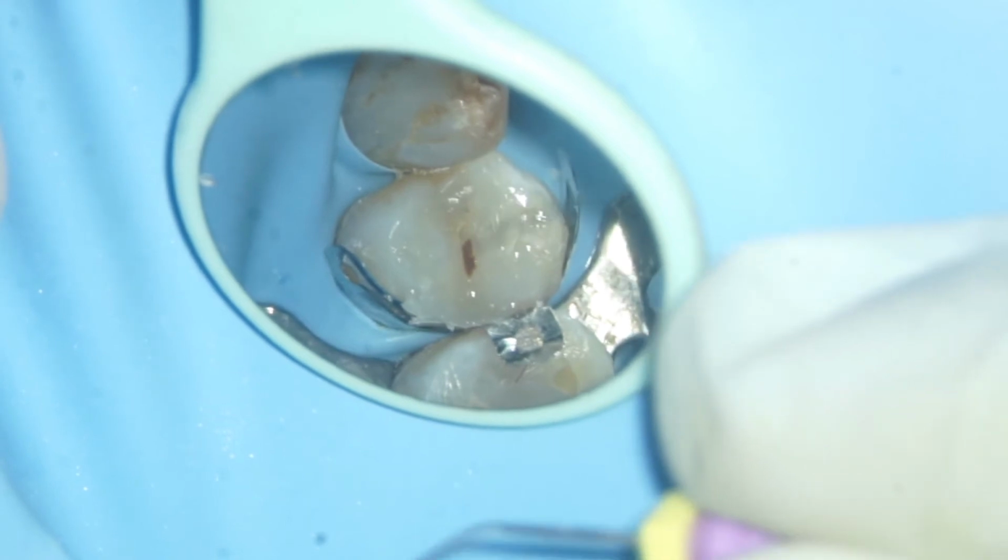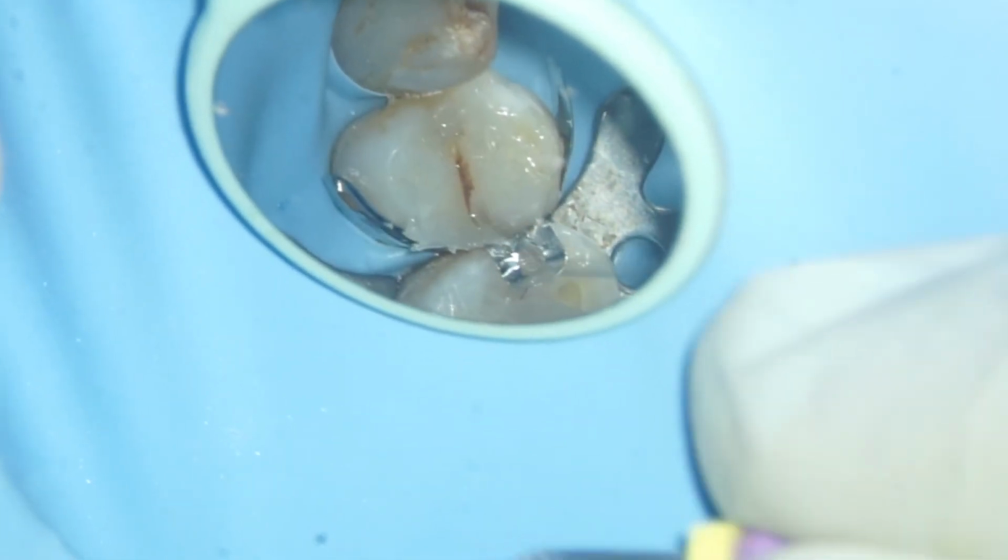So now we are almost done with the palatal cusp. You can see already the anatomy is almost fine. I am using a micro brush to blend the composite with the existing tooth structure. So now the last increment is to make the marginal ridge. The most important thing is the level of the marginal ridges on the adjacent teeth should be equal so that the forces do not separate the teeth and food impaction is not there.